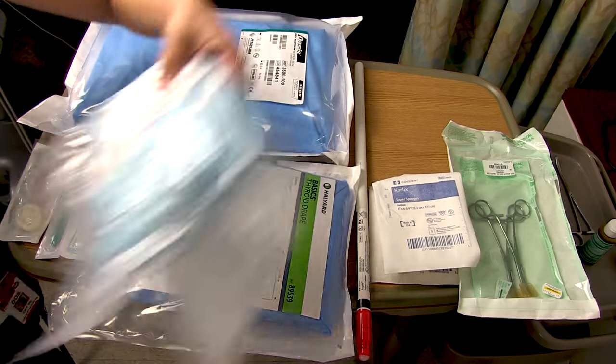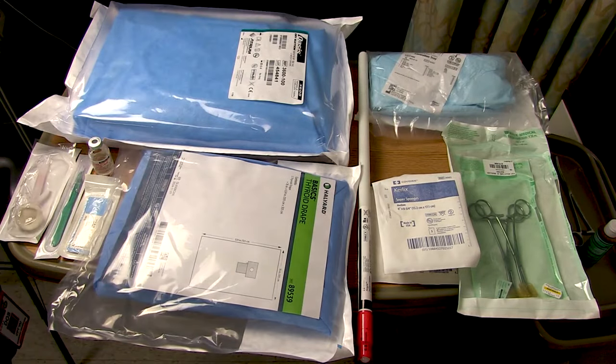First things first, let's go shopping in the hospital supply room and get everything you could possibly need. I'll talk about the equipment now, but if you're short on time, you can skip to the procedural steps in the playback bar below. I will list all the equipment in the video description.